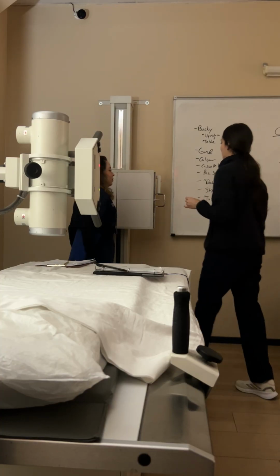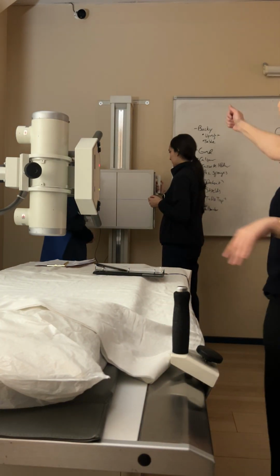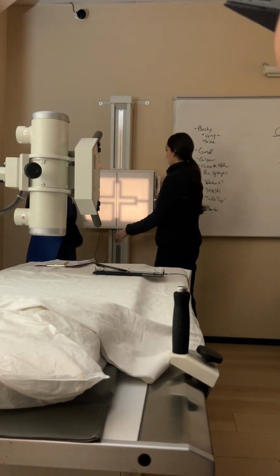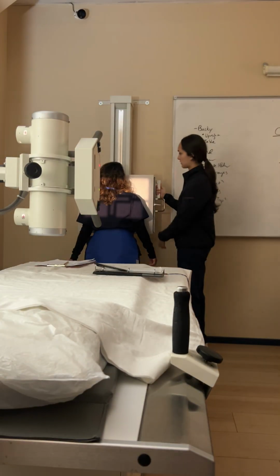That's about it. Also, at some hospitals, when you move that, this also moves, like when you detent it. So this is very old school, but it will be a lot easier with a newer one.